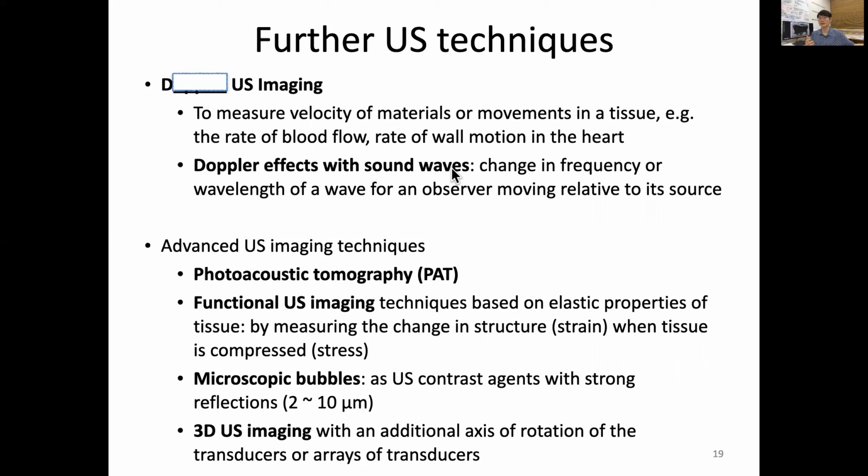You know that the sound of an incoming train versus a going-away train gives you a different pitch, a different frequency of the sound. That change in frequency or wavelength of a wave for an observer moving relative to its source can be utilized as Doppler ultrasonic imaging for functional imaging.